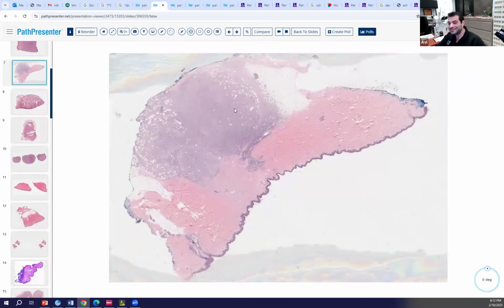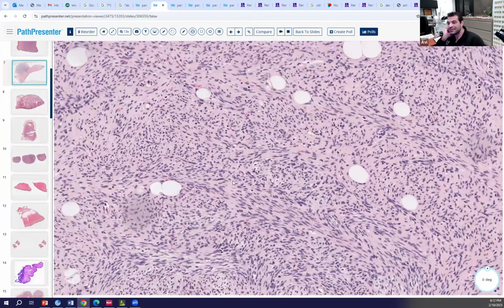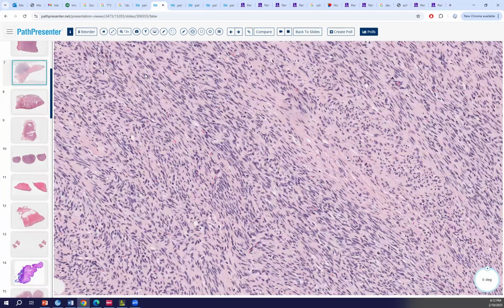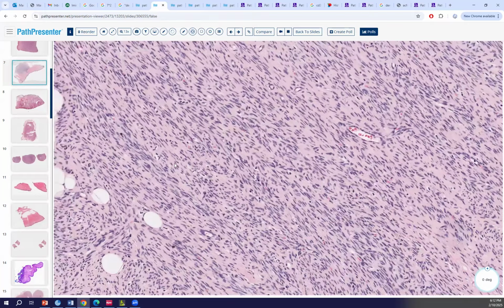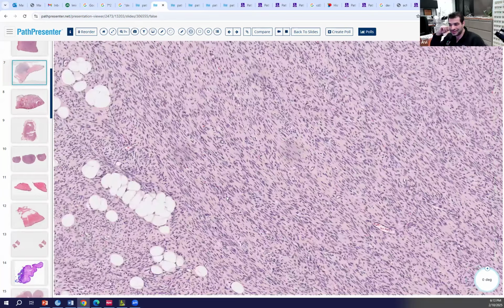So this one's also infiltrating the fat, you may notice. But look what's different. In fact, I want you to describe and tell me what's different. Yeah, so at least to me, it looks like it has more of that honeycombing, which is like the alternating directions of cells, kind of. You mean storiform? Yeah, sorry, that's what I meant. Storiform. Yes, storiform growth pattern.